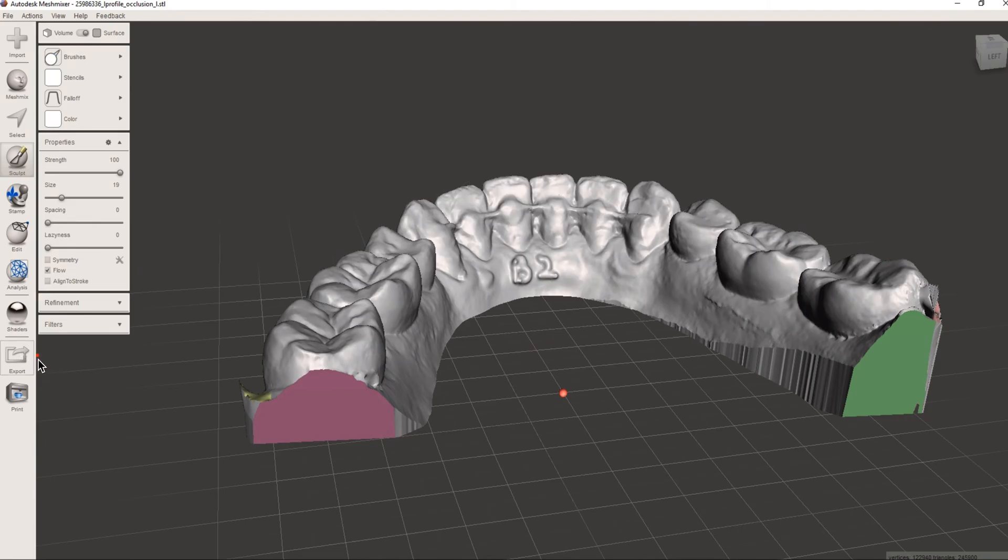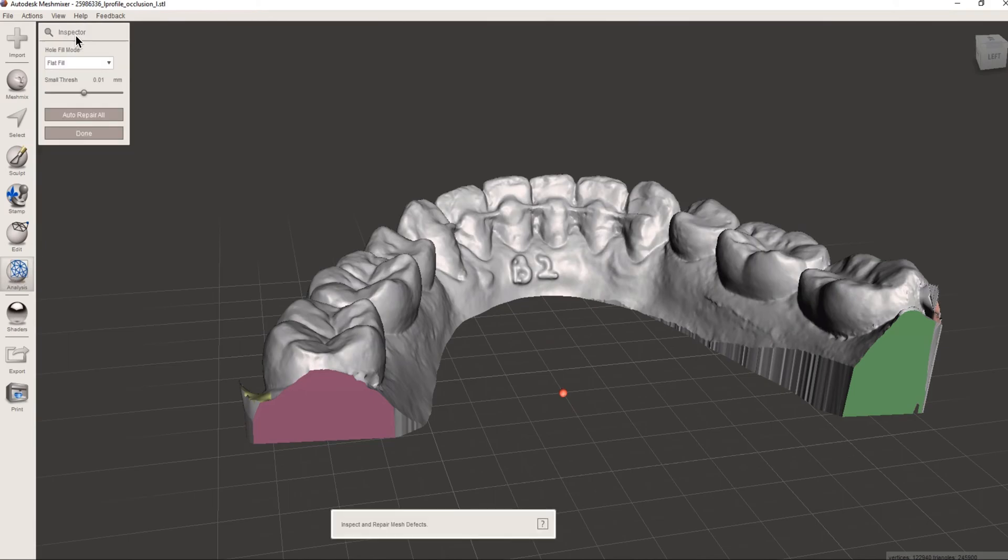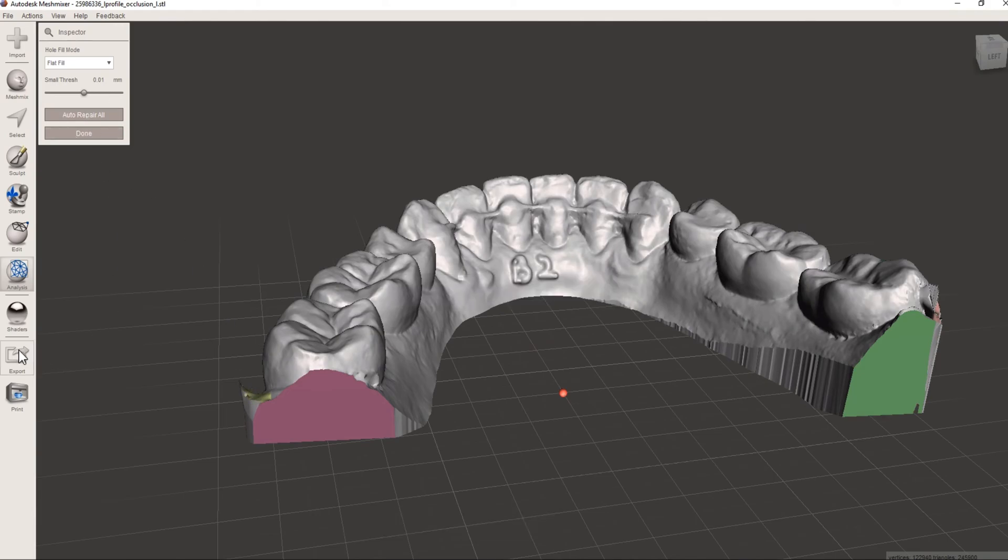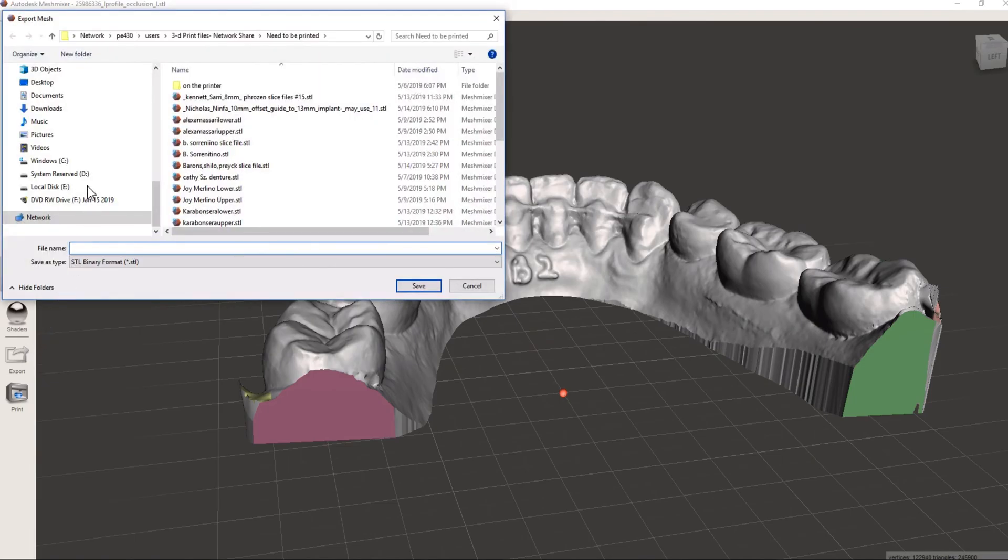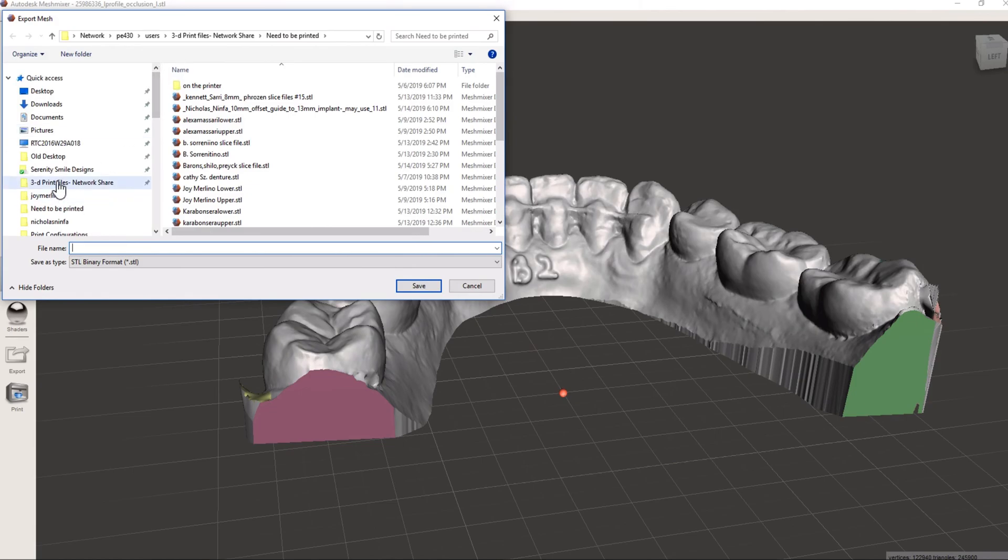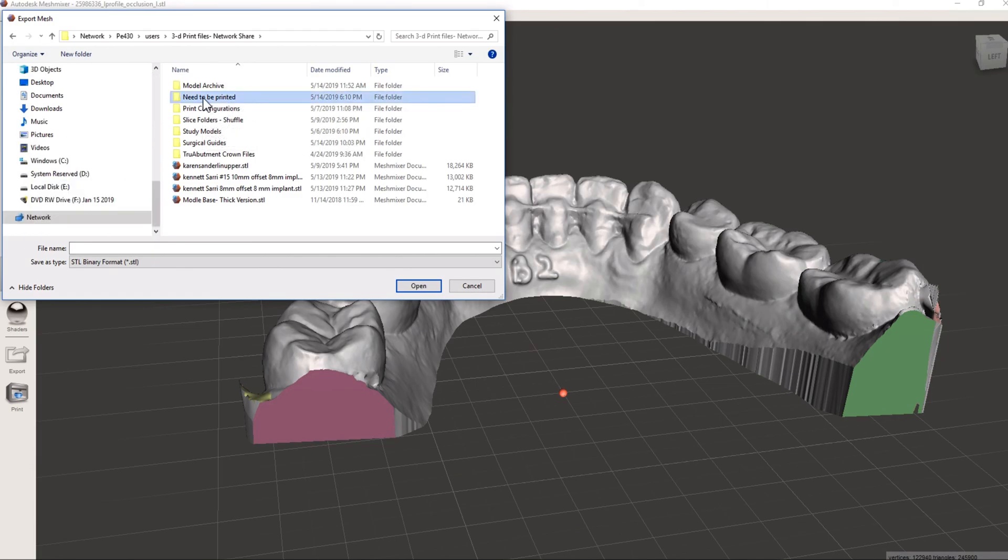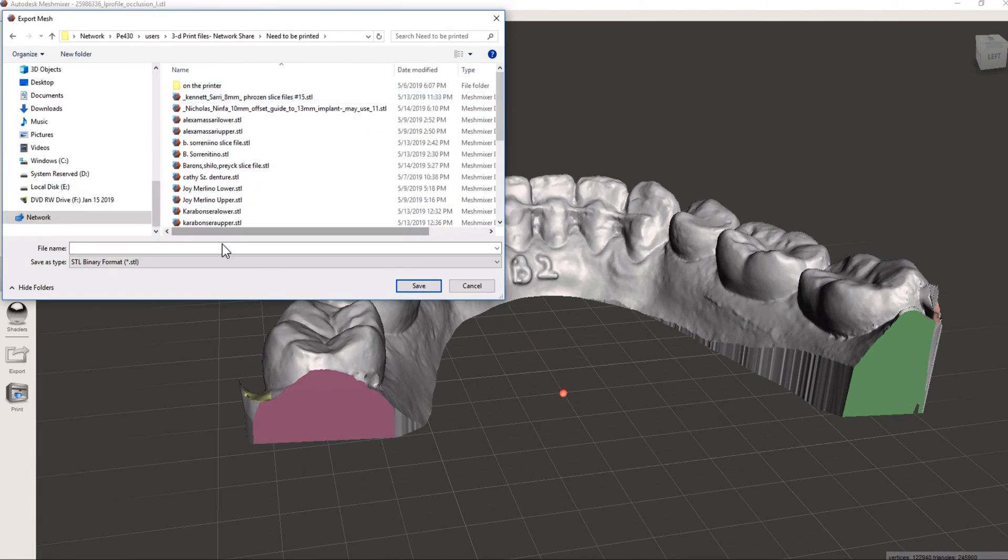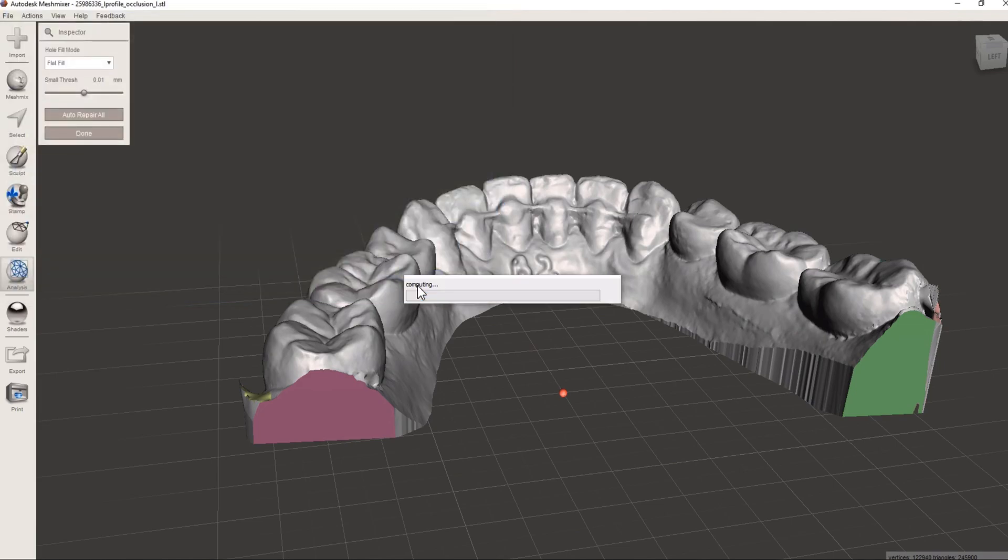So we would, well, before we print, it's always good to hit the inspector one more time, analysis, inspector. If there's any arrows, it'll point to like we did before, and then we auto repair. Now we just export. And in our system, under network share, there's a folder that says need to be printed. So if we click on that, and we can just save it. And now it's ready to print. We'll drag it on our print bed and good to go.